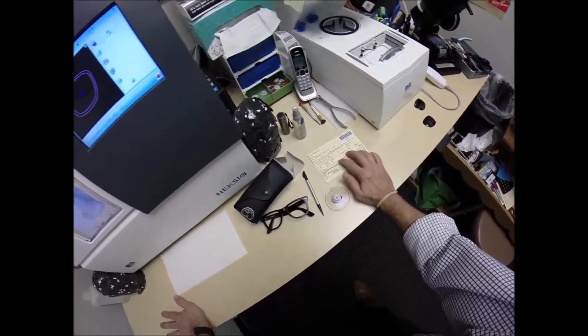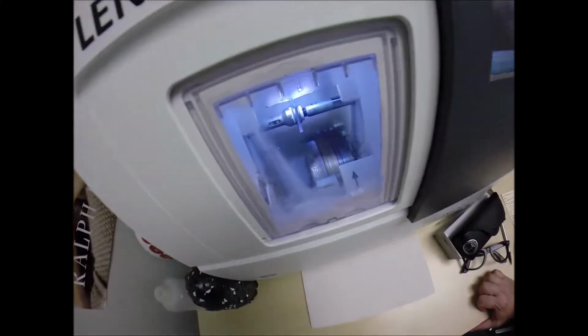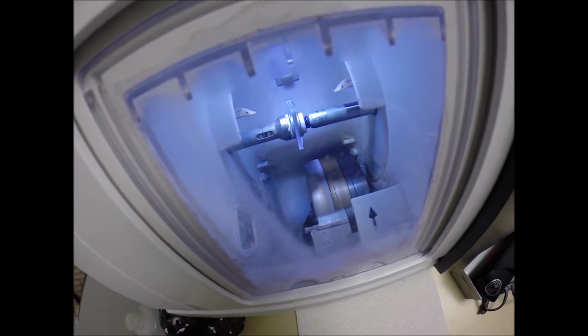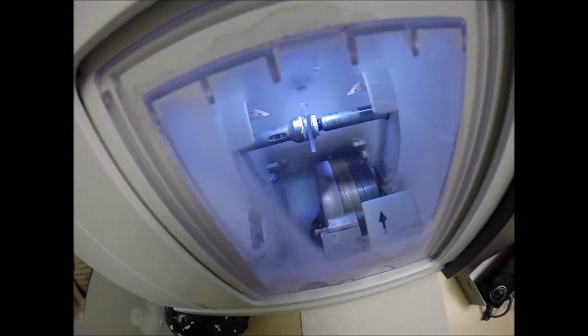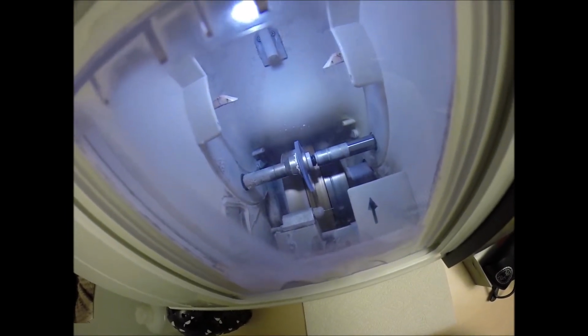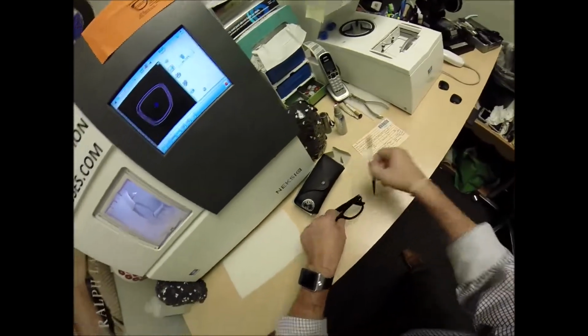Now you've got the Crizal Easy Anti-Glare. Crizal is 3 features in one, and I'll get to that in a minute, but if you notice, your lens is completely flat around the edges like a nickel. If I were to take it out now, it would stand up on the counter. Now it's going to drop down and get the bevel, the V-shaped bevel, the knife-like edge, if you will, to go inside the bevel of the frame.